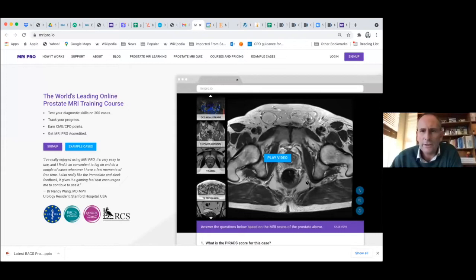All right, hopefully you can see this. I'm just going to play a very short video just so that you can see how MRI Pro works.